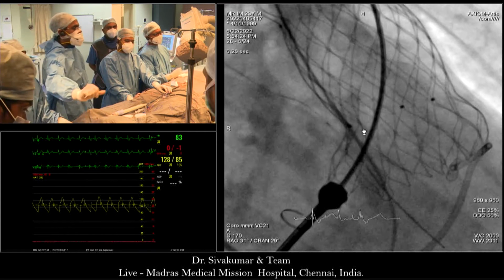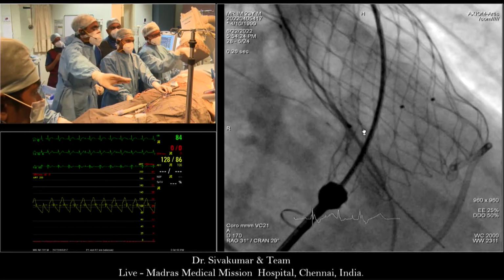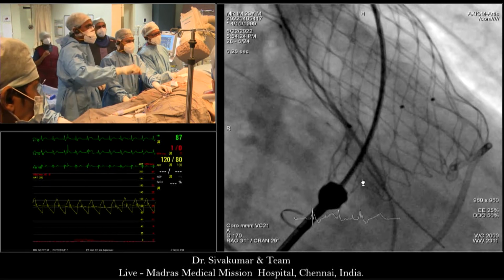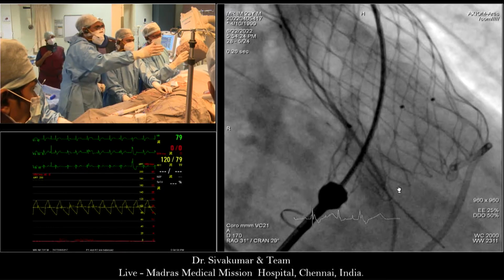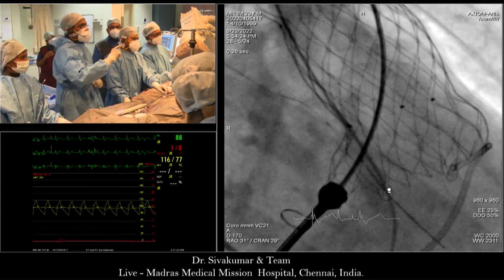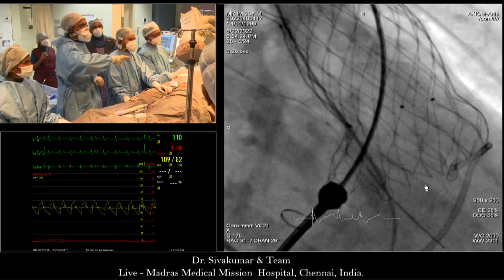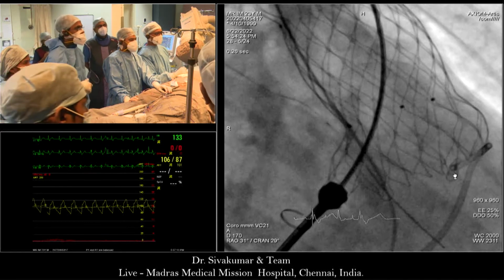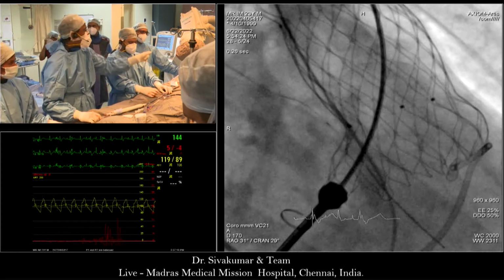Shaq is trying to point with his hand, but it's not tall enough. Okay. Now come down. Take your arrow down. Come to the right a little bit. Right further. Stop. Little left. You see, that is one ear. And now go across. Is this Shaq's hand? Okay, this is one ear and second, just go up. That is the second ear. Now get back to normal mag.